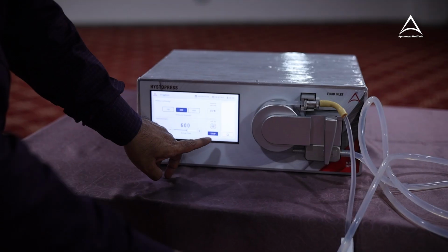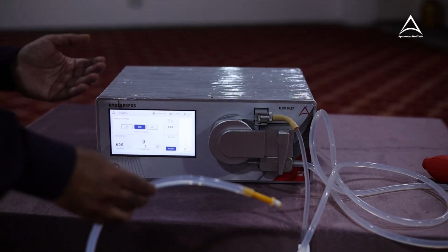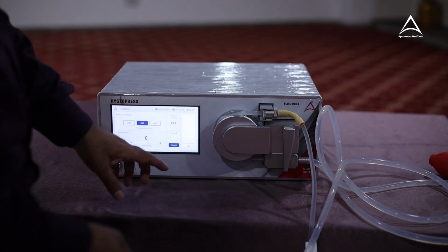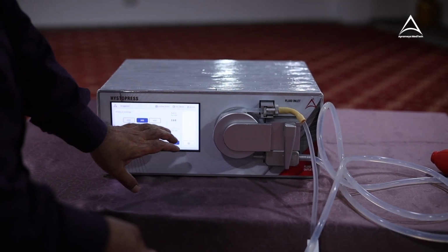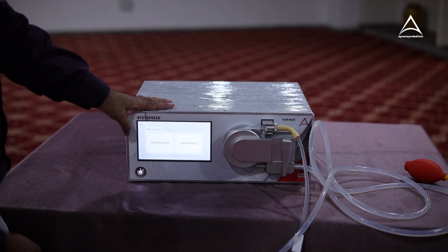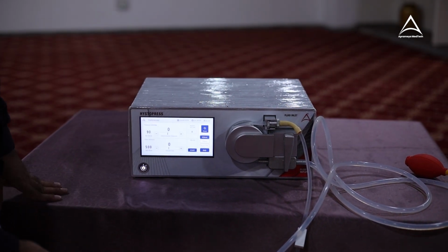Now whenever irrigation is over, you just stop it. Now how much fluid has gone inside the abdomen? So it is mentioned here, approximate volume. So right now it is showing that I have used 398 milliliter. Now once this case is done, I'll simply go to the. Now let me tell you what are the safety features inside our machine. So let's go to hysteroscopy.